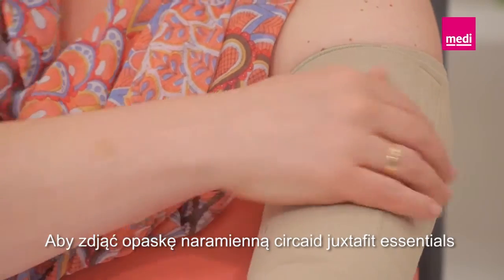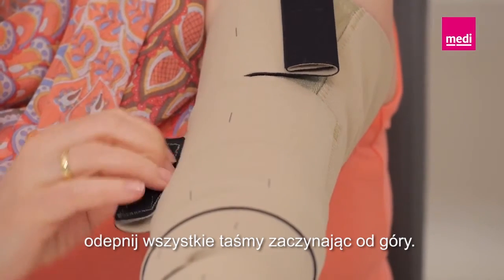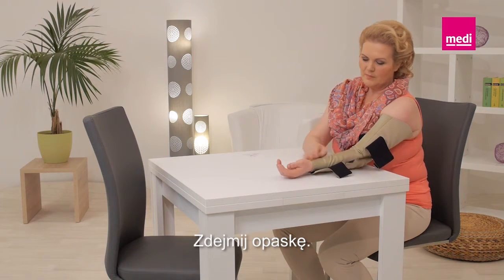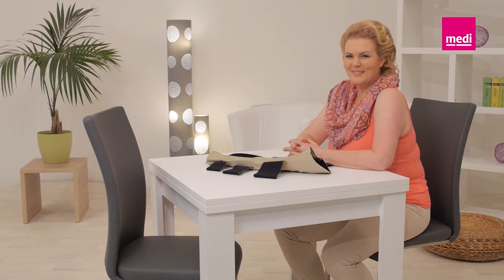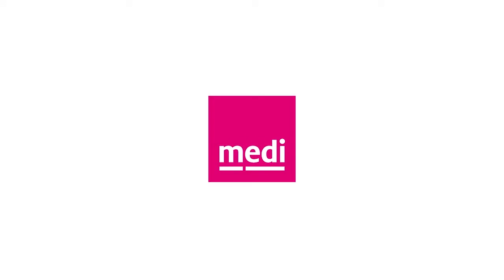To remove the Circade Juxtafit Essentials arm, detach all bands starting with the top band. Fold each band onto itself to keep the Velcro tabs lint-free. Remove the garment.